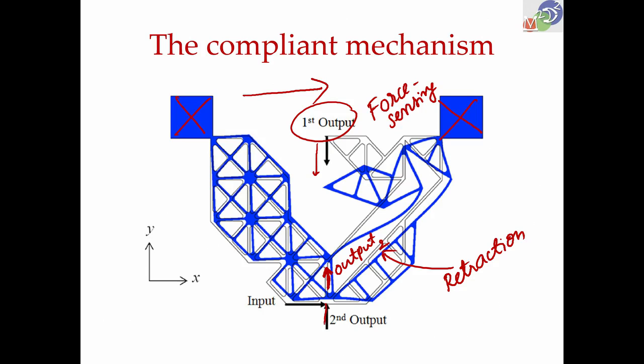So, let us say that the scalpel is like this, and we have the specimen to be cut over here. The specimen is here, when this moves like that, the cutting force of course will come like that, that will make it go up. So, depth of cut will change a little bit depending on the stiffness.